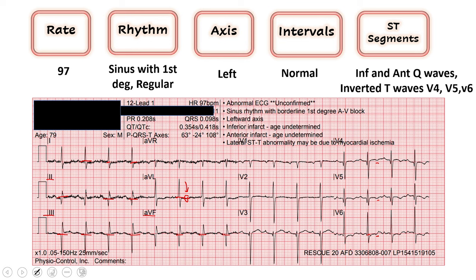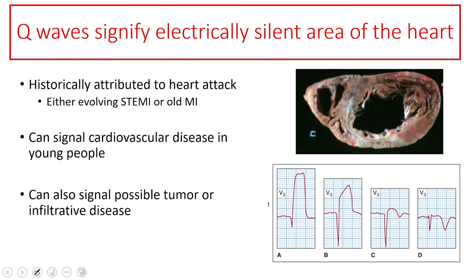So what I've got here is T wave inversions in the lateral anterior-lateral leads, and then a little bit of elevation in lead 3. I would get another 12-lead pretty quickly after this one to see if anything evolves, and you start to develop more ST elevation in the inferior leads. These are very subtle changes. But the other thing that's worth noting — and this is what we're going to talk about today — is these Q waves. Do you see there's a big downward deflection in all of the inferior leads of that initial Q wave of the QRS complex? Let's talk about those for a second because they can signify different things. Some of them can be normal depending on where they are, but there's such a thing as pathologic Q waves, and that means that something either has happened in the past or is going on right now, and you need to be in tune to it.